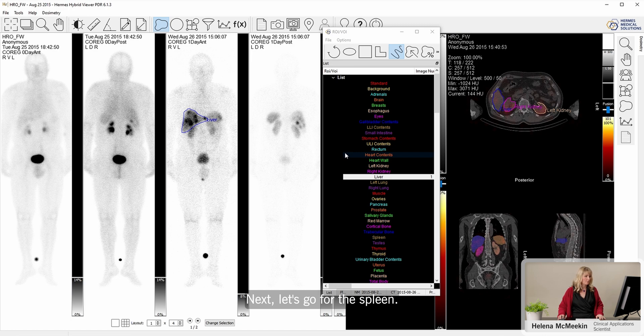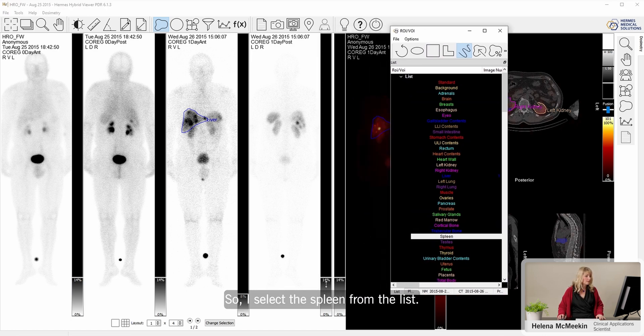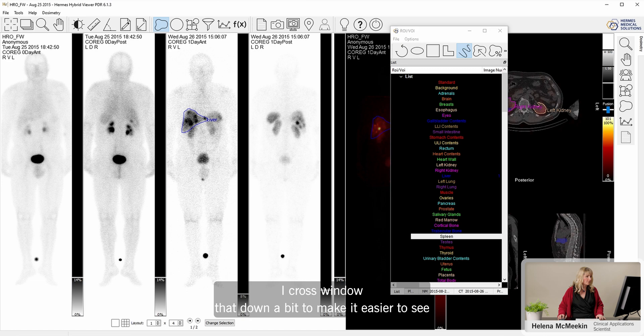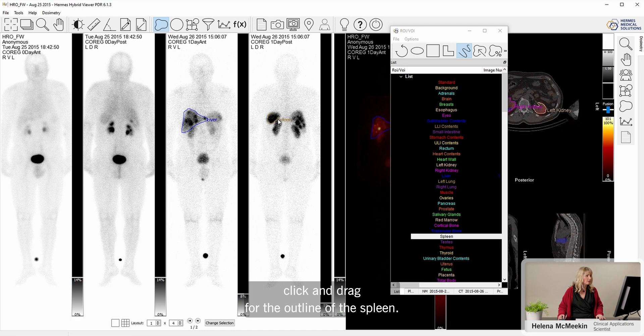Next, let's go for the spleen. So I select the spleen from the list, move that across, window that down a bit to make it easier to see, click and drag for the outline of the spleen.